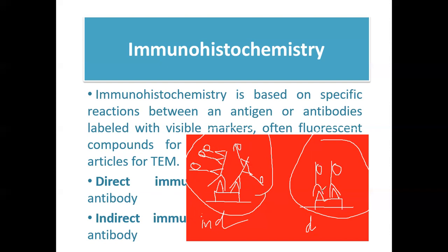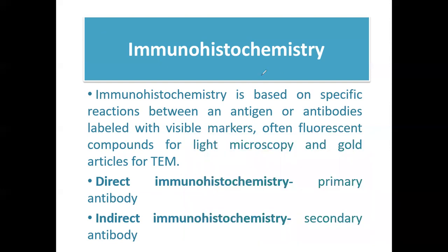Unlike here, dalawa yung antigen mo, so dalawa lang yung antibody that will bind it kasi isa lang yung ginamit mo. You're using the direct technique. Okay? So that's the difference between your indirect and your direct immunohistochemistry. So mamaya makikita natin, guys, what's the difference. Okay, other than of course your indirect technique is more sensitive than that of the direct technique.